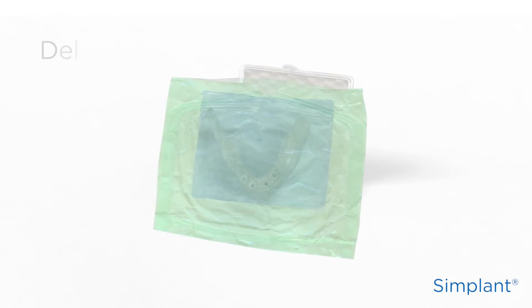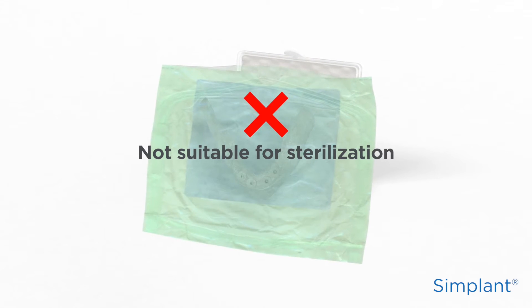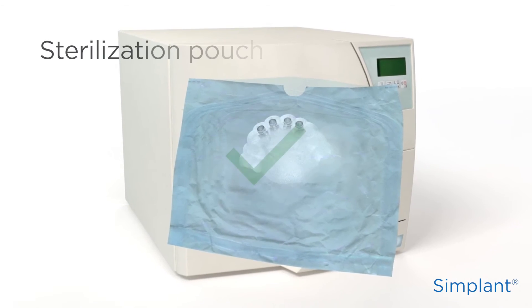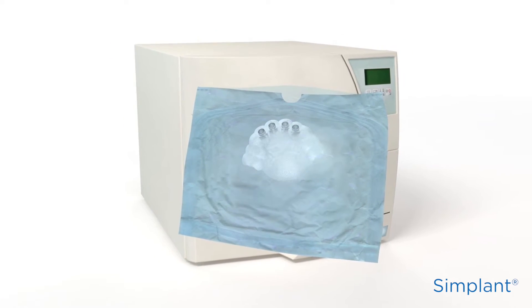The pouch in which the Simplant Guide is delivered is not suited for sterilization. Remove the Simplant Guide from this pouch and follow the cleaning and sterilization methods specified in the Simplant Guide instructions for use.